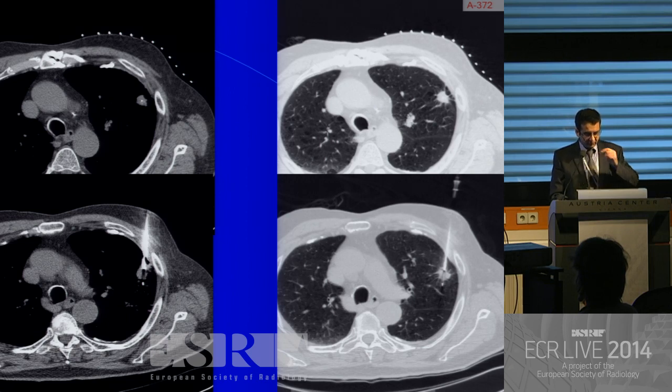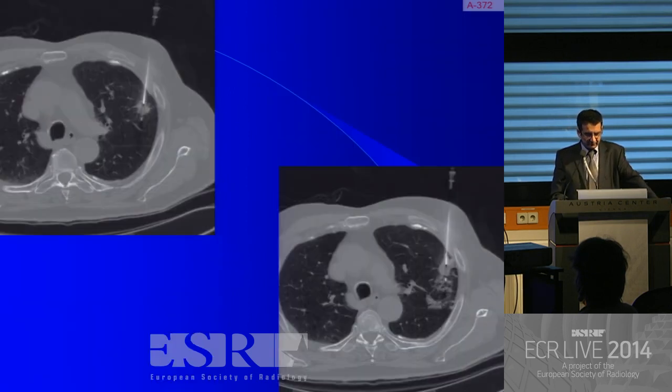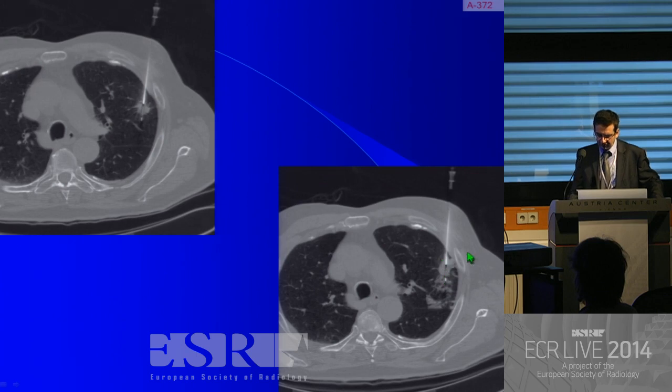Lastly, a patient with a left upper lobe lesion, standard biopsy technique, CT guidance, as I've explained, some pulmonary hemorrhage. It's not unusual that you see this, and perhaps the throw of the needle here is a bit too much, and that's why we're seeing a bit more hemorrhage on this side here. And we could have retrieved that bit back.